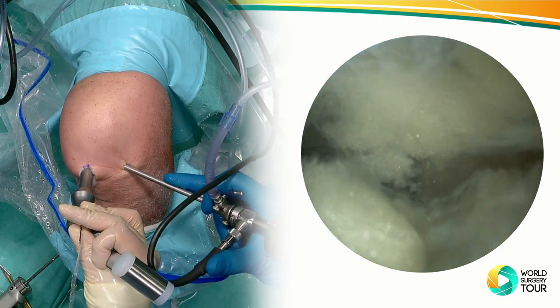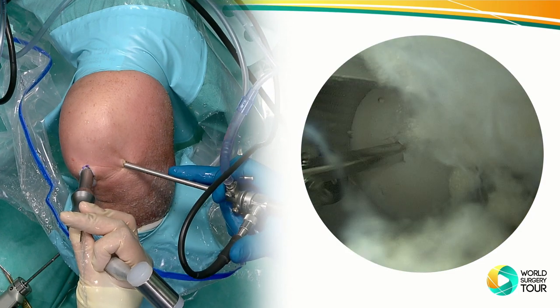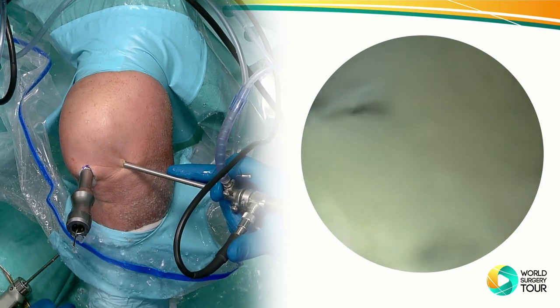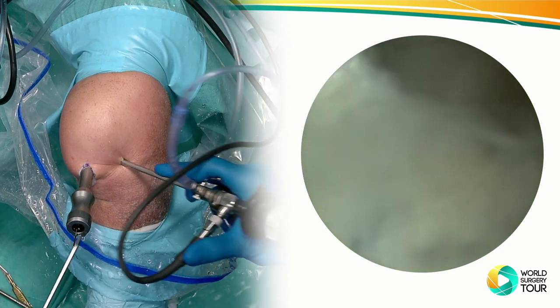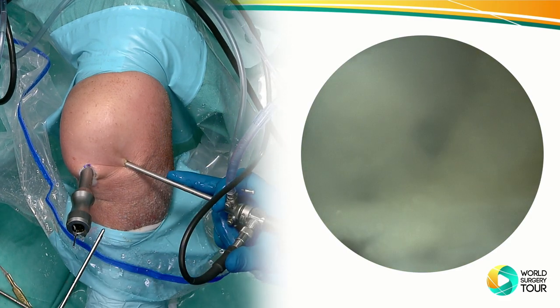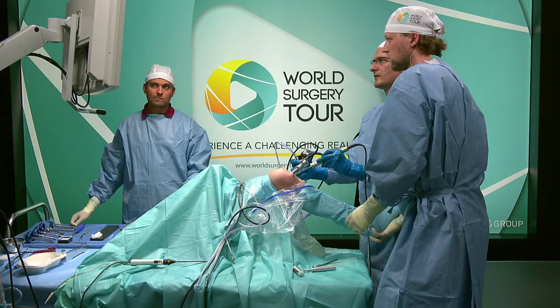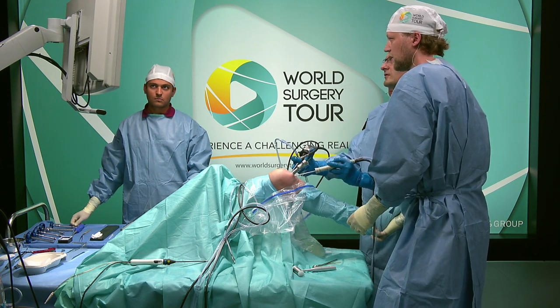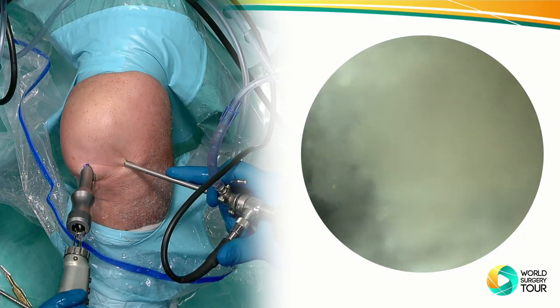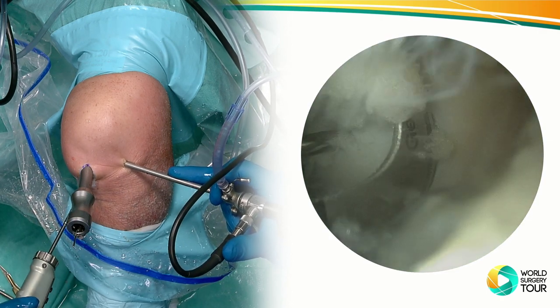What you can do now is I would take a shaver blade. Can we let it hang a little bit? That should work. I really like to see a little bit more. Okay, that's good. Perfect. Here we go. Not yet, I'll be getting there.